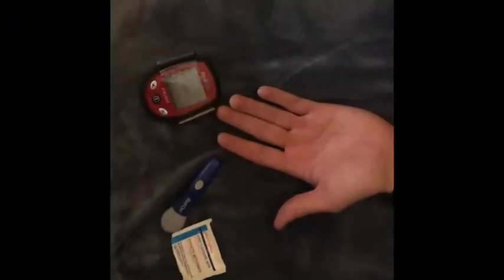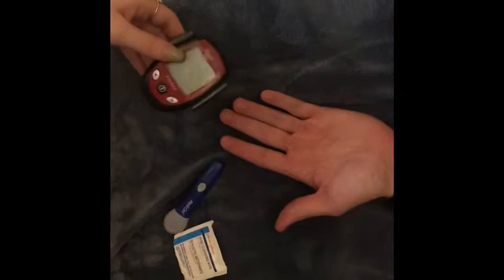You're going to place this in here, then twist the cap and place the lid on top. Okay, so today we're going to be doing a glucose meter reading.